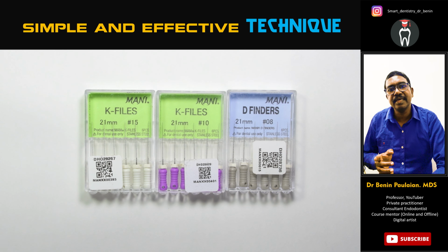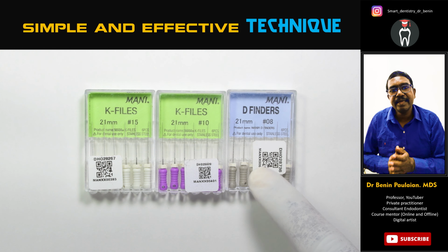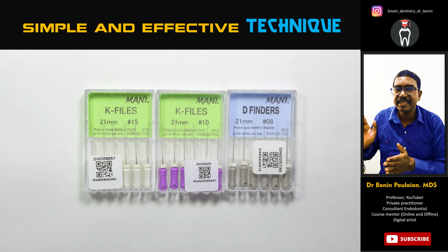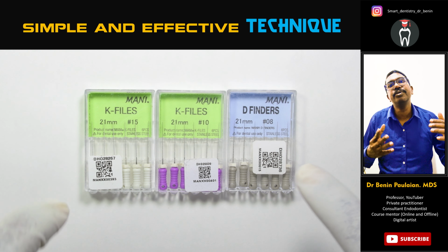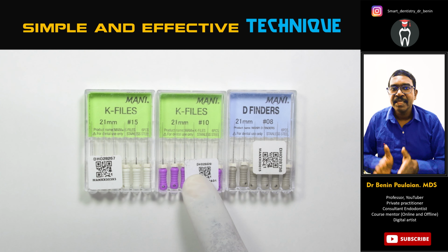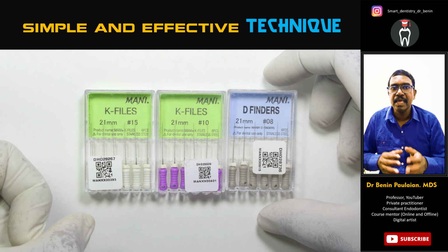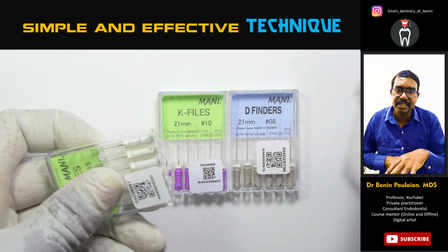So these are the files that I have just mentioned: a 15 size K file, a 10 size K file, and an 8 size definder, in the sequence of using 21 millimeter 15 size, 21 millimeter 10 size, and 21 millimeter 8 size. You may wonder that if the root canal is quite long, why can't we use a 25 millimeter file? Trust me, the shorter files, that means the 21 millimeter files, are more rigid compared to that of 25 millimeter files. And for canal negotiation, we need a file which is rigid and flexible at the same time.